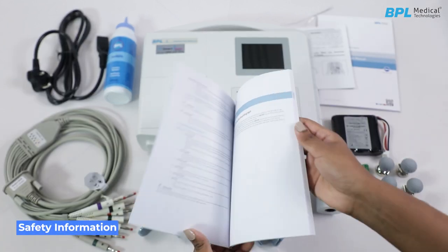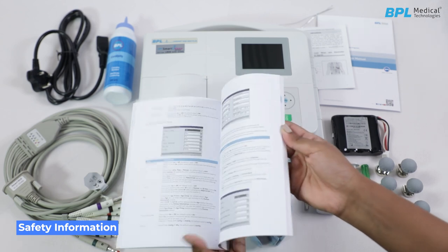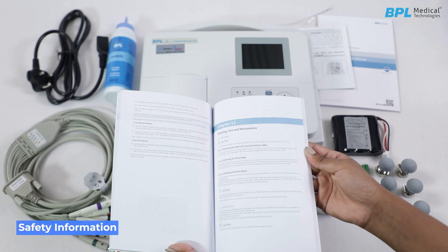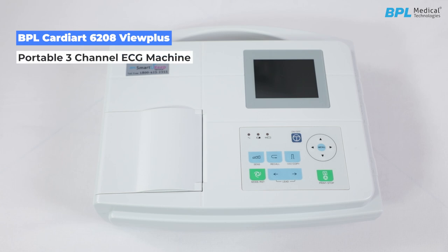Safety information. Read the user manual completely before operating the machine and use original accessories supplied by the manufacturer. The BPL Cardiac 6208 View Plus is a portable 3-channel ECG machine with a 3.5-inch color display, extensive connectivity and internal storage for 500 ECGs.